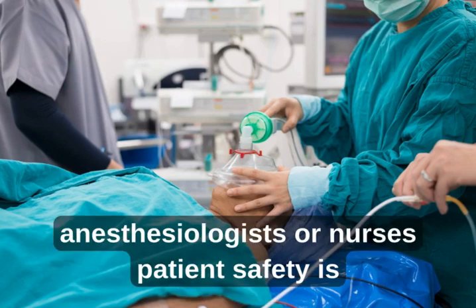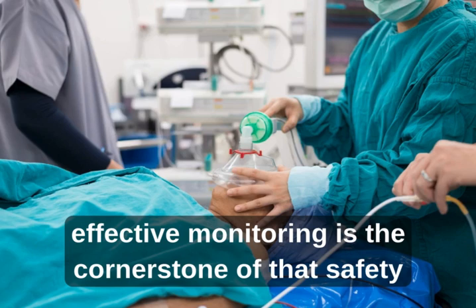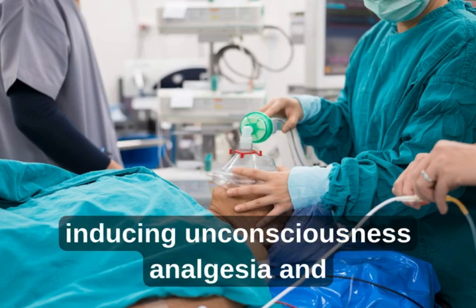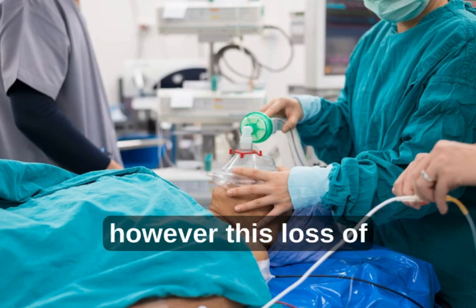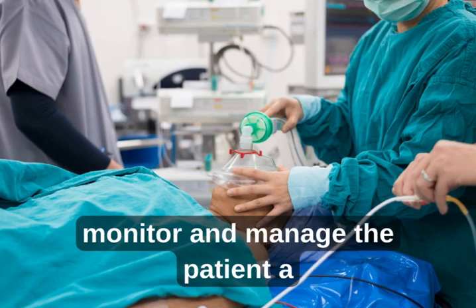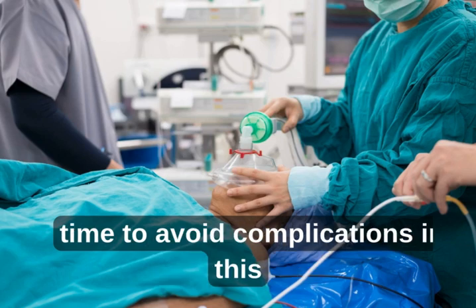As anesthesiologists or nurses, patient safety is our utmost priority, and effective monitoring is the cornerstone of that safety. General anesthesia, by inducing unconsciousness, analgesia, and muscle relaxation, allows us to perform surgeries safely. However, this loss of consciousness also demands that we carefully monitor and manage the patient's physiological status in real time to avoid complications.